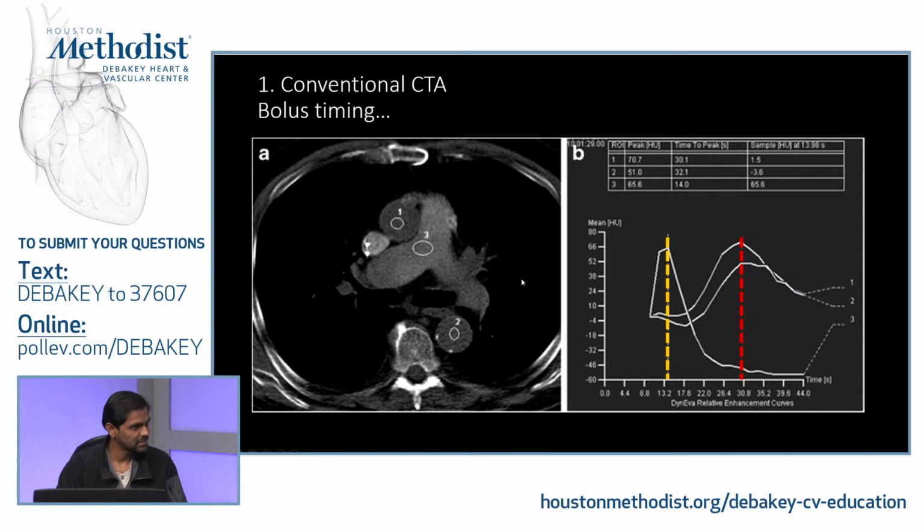You don't often get into acquiring these images, whereas here in the operating room we control the dynamic, or what I call dynamic, which is digital subtraction angiography in 2D, where you control the contrast injection and you trigger the acquisition. Whereas if you have a CT technologist, they have two options.